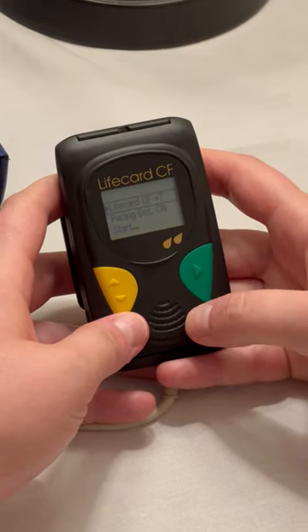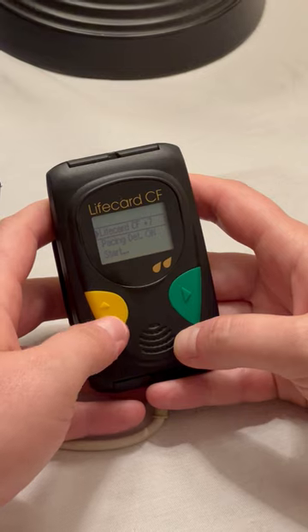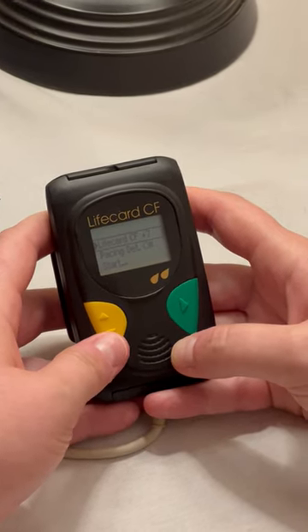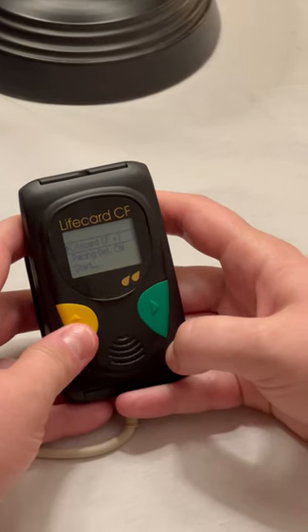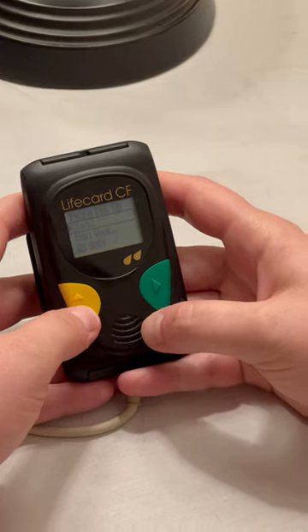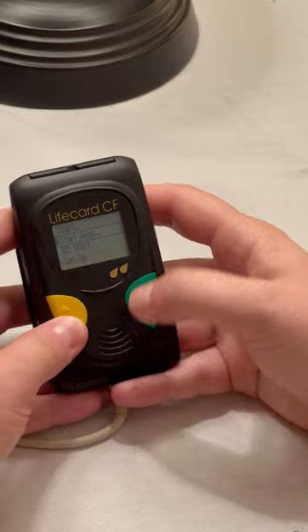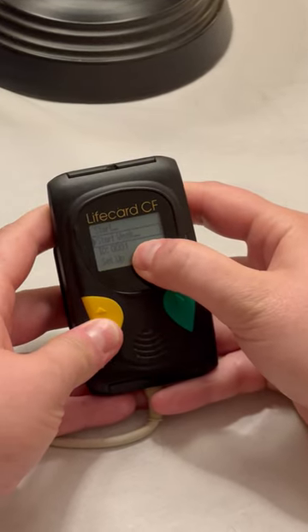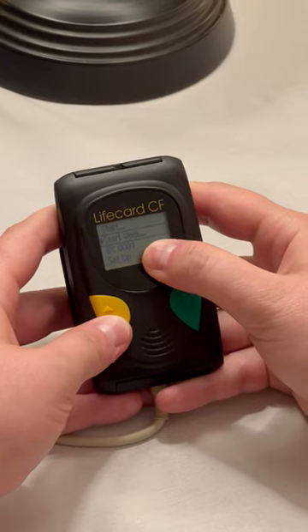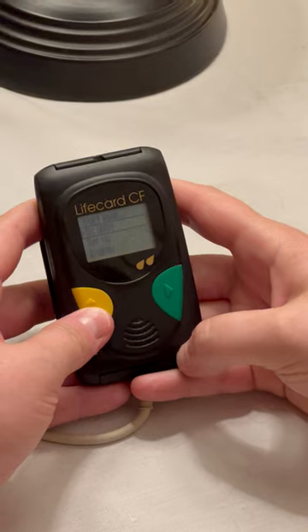We are going to show how to do the setup on the Holter monitor. When the battery and the memory card are removed from the device, it may reset the date, the time, and the ID number. This is the main screen when we're starting. If we use the arrow keys to scroll down, 'Start' is how you get to your recording, but first we want to make sure the ID and setup is correct. Your dog will be assigned an ID number so we can keep the material allocated to each dog appropriately in case the microchips get messed up.